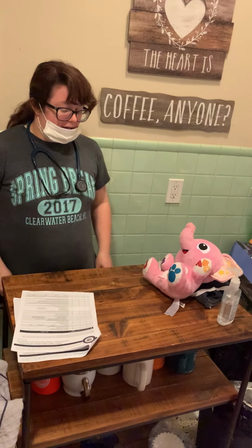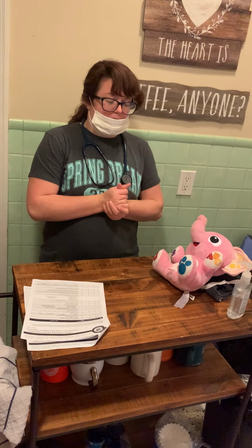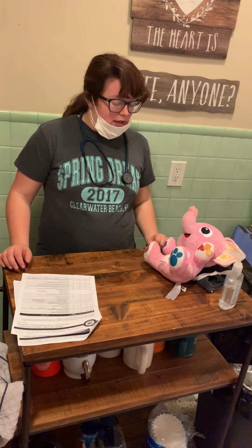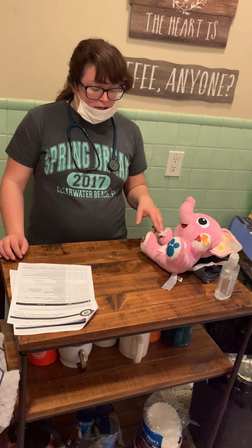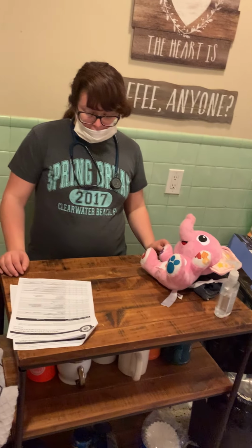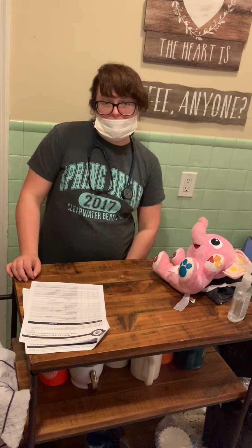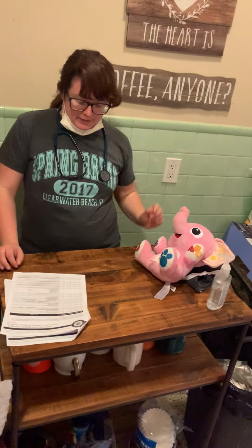I have my bed raised to hip level, and I'm going to first begin by assessing my patient's abdomen for distension and observe the perineal area for any redness, sores, rashes, or breakdown of the skin. My patient is in supine position, and I have lowered the head back as low as comfortable for my patient.